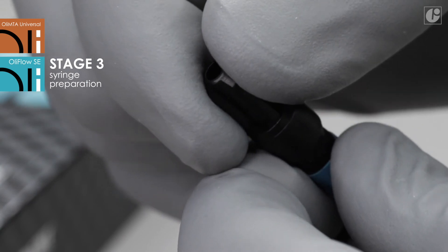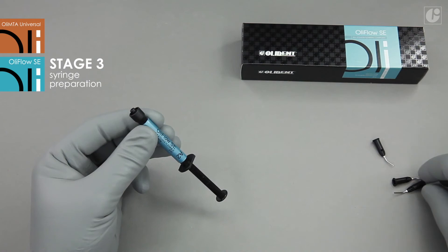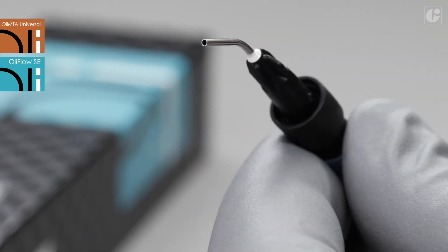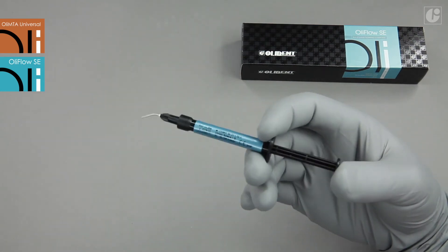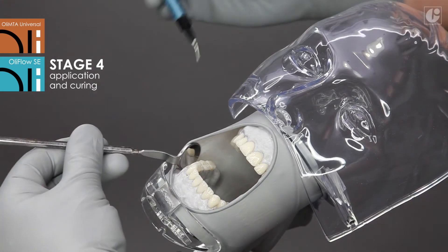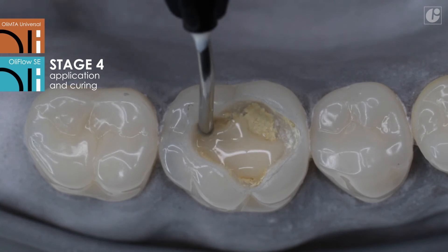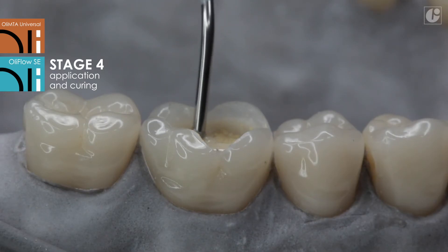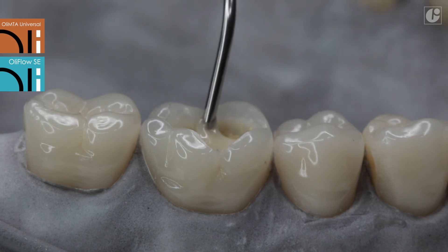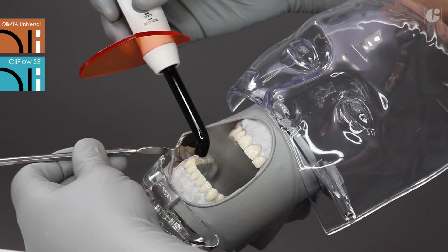Remove the protective cap and attach a safe tip. The material is ready for use. Apply the appropriate amount of OliFlow SE directly from the syringe on the cured layer of OliMTA Universal — first cover the bottom, then the walls of the cavity. The maximum layer thickness is two millimeters each, with a curing time of 20 seconds.